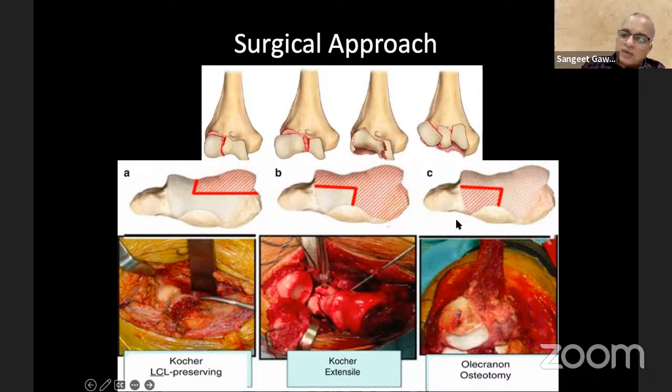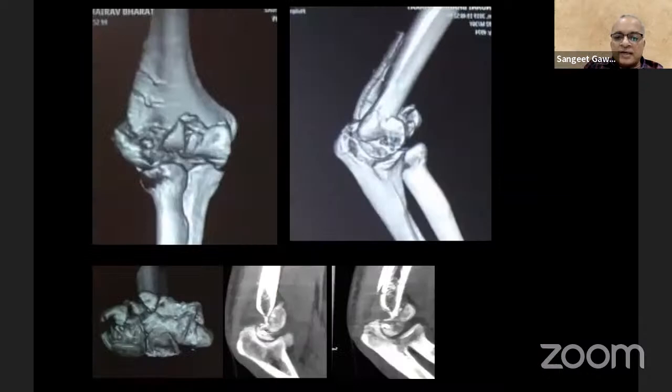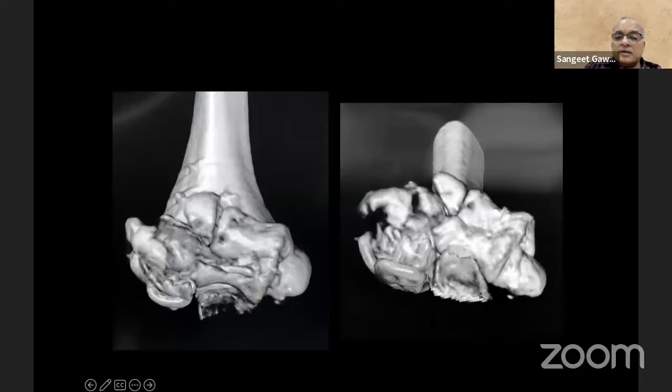Now, coming back to our case, this is his post-op CT. You can see at 3 months what has happened. That entire fragment has got fixed. It is fibrosed and it is now adhered anteriorly just above the coronoid fossa. And inside the joint, because of the comminution, you can see what has happened there. And this is his subtraction view, where you can see a big fragment of the trochlea. Then we have a comminuted capitulum fracture.